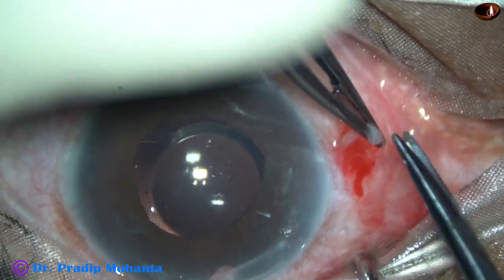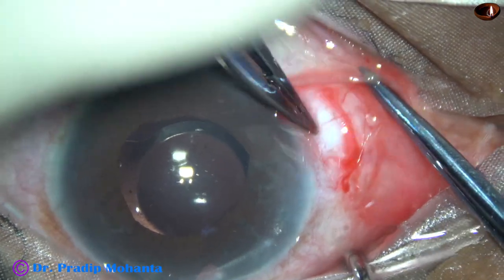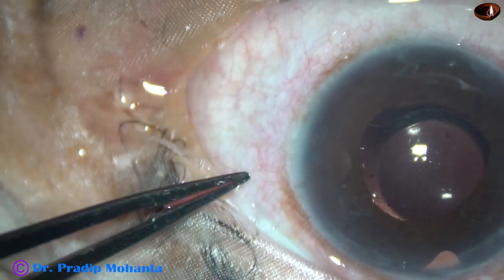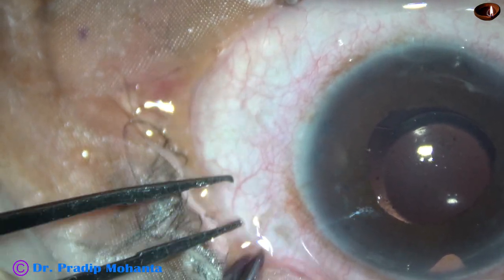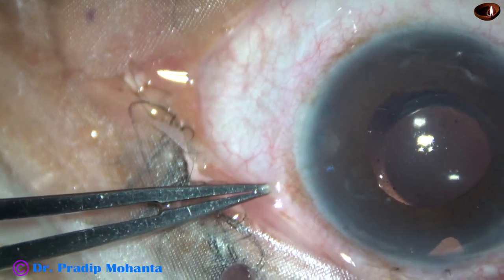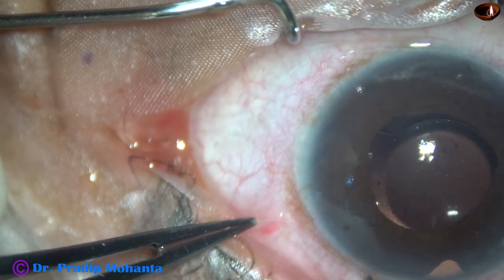The patient came after one more week with flat anterior chamber all around. Intraocular pressure was 46 mmHg and I decided to take up the case for surgery. My plan is to do three-port vitrectomy and gonioiridectomy.